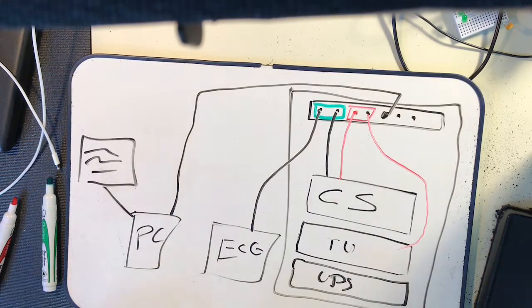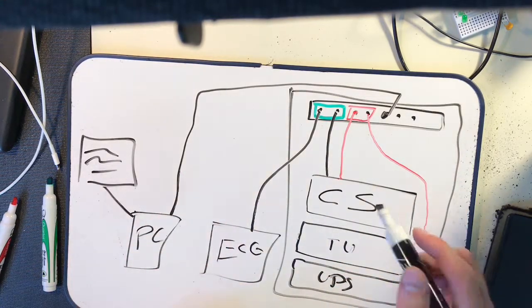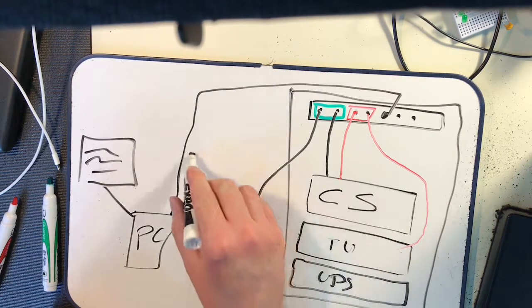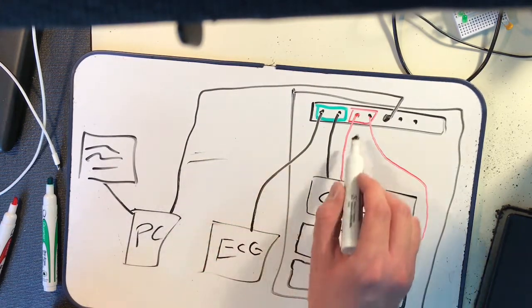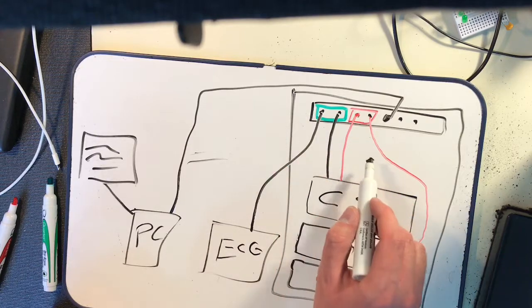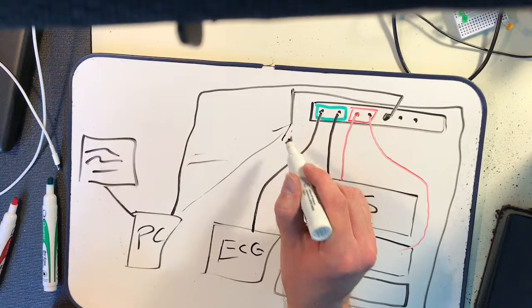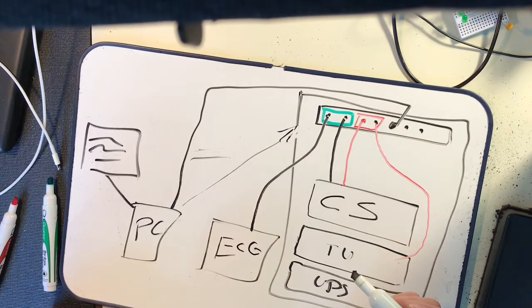But to set up the VLANs on the switch, if you've had networking classes, you probably had Cisco. They did it all probably from the command line. This switch in particular uses a web interface, so you need to go on your PC and go to that web interface and configure it that way.